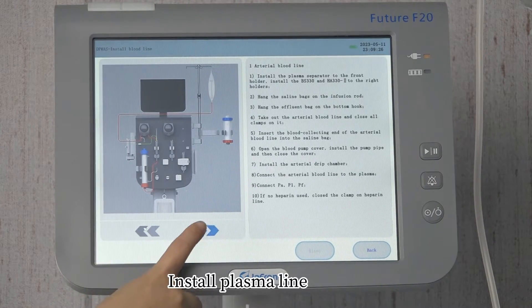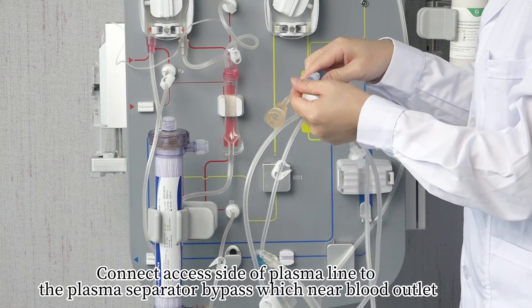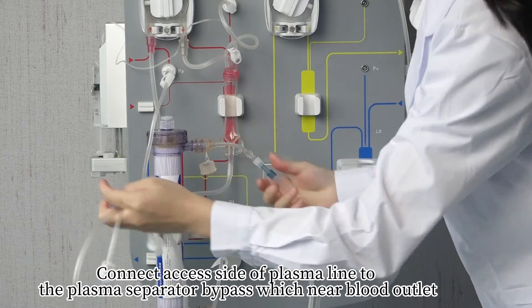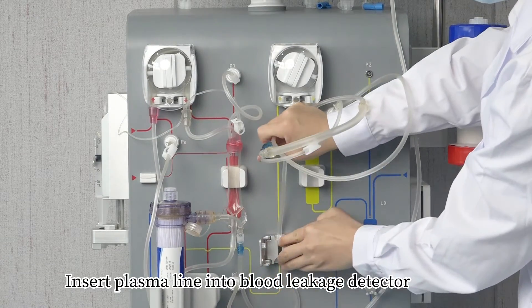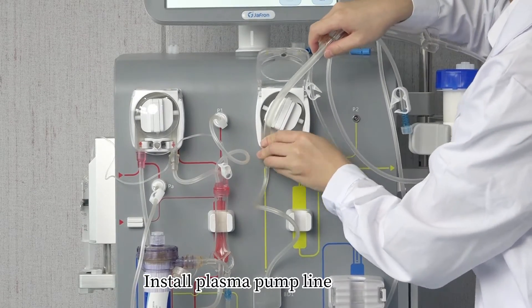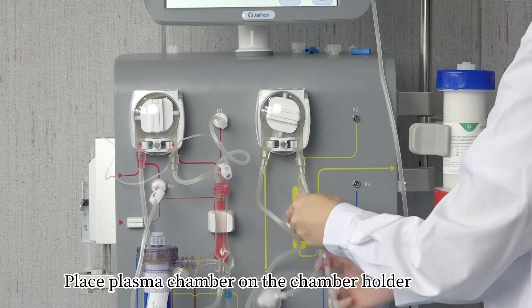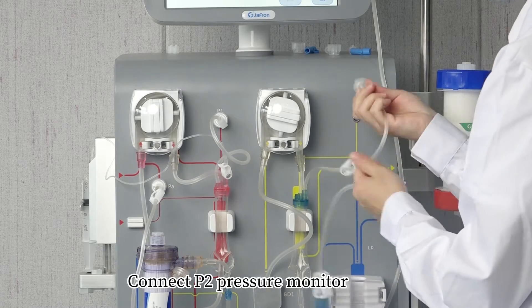Install the plasma line. Place the plasma chamber on the chamber holder. Connect the P2 pressure monitor.